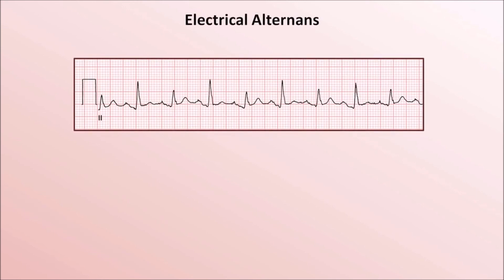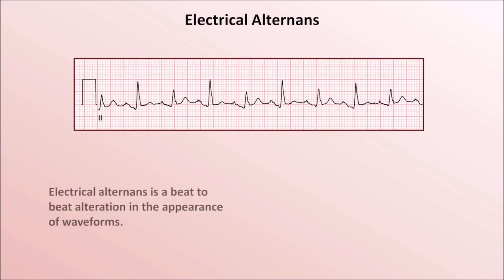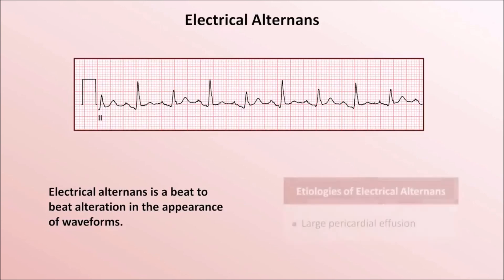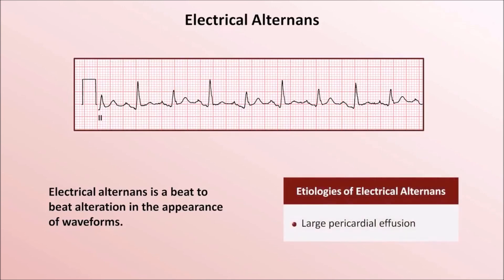The last abnormality of this video is electrical alternans — a beat-to-beat alteration in the appearance of waveforms. It most commonly manifests as a tall R-wave alternating with a short one. The only significant cause of this is a large pericardial effusion in which the heart literally rocks back and forth within a distended pericardial sac with each contraction.